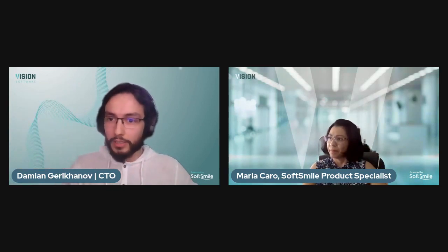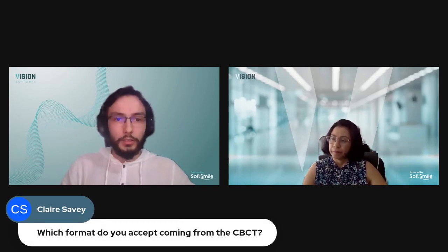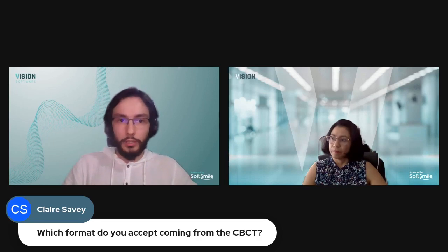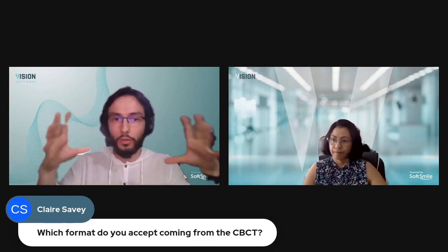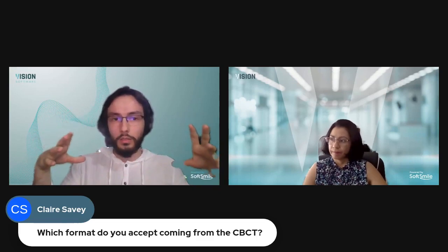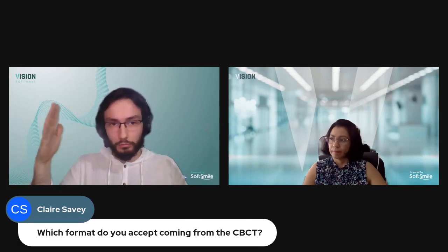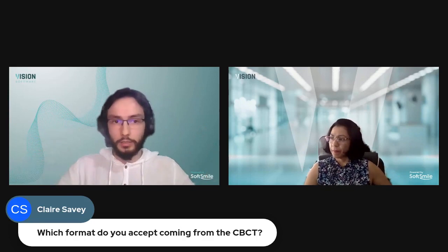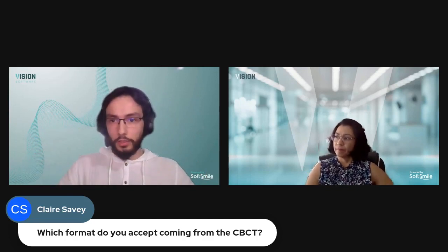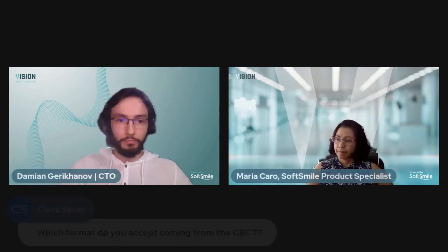Which format do you accept coming from the CBCT? Right. Which format do we accept? It's, of course, DICOM. The industry standard DICOM format can be either a single file, a zip file containing all of that information, or a folder, just like Maria mentioned, of like 100 or 200 or 300 files of these slices that the CBCT device produces. So these are the formats. Industry standard DICOM is the format that we support.